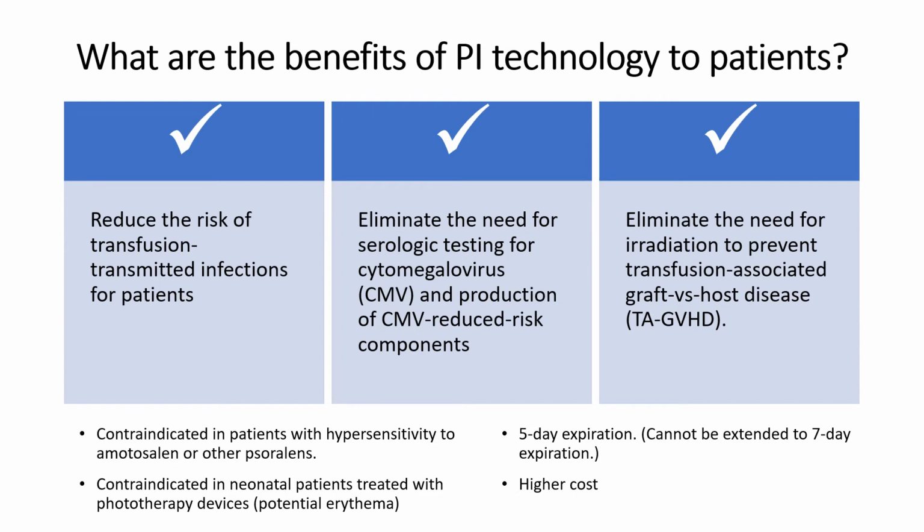This has caused somewhat of a logistical puzzle in some computer systems, where the software is checking for CMV negative and irradiated attributes to meet patient transfusion requirements. Some of our BCS clients have created workarounds for this issue, or simply adjusted SOPs to include internal controls to override the computer warnings that display. I would not recommend adding a CMV negative attribute to pathogen-reduced platelets unless it was truly tested and displayed on the label. The same goes for the irradiated attribute, as irradiation is not recommended for these products.